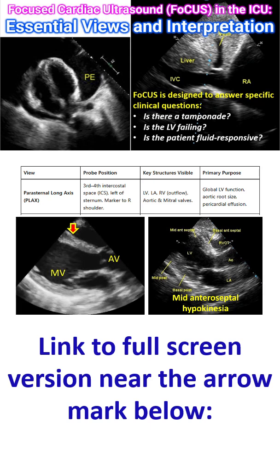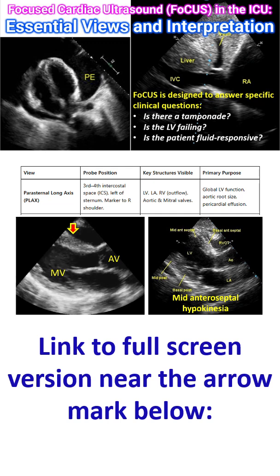You can see the right ventricular outflow tract, left ventricle, aorta, left atrium, mitral leaflets, and aortic leaflets in this view.